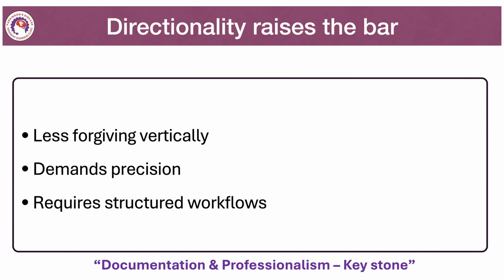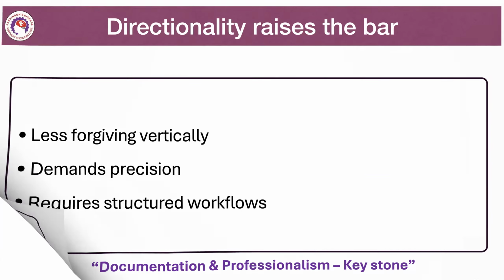Even though you spend good quality time during the first assessment and programming, this documentation and professionalism is the keystone for management of DBS. This is very critical for you to understand. If you do that, it helps you in the long run. Don't worry about the time. The importance is long term. The time you spent on the first programming or initial assessments will help in the long-term management.